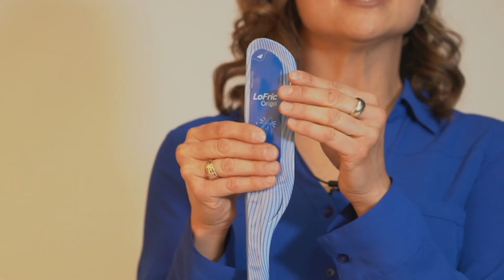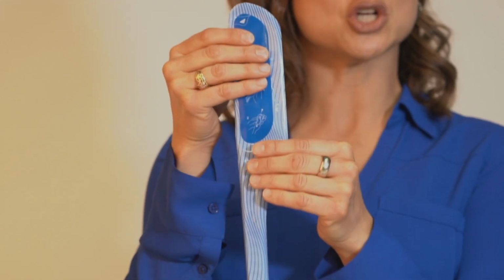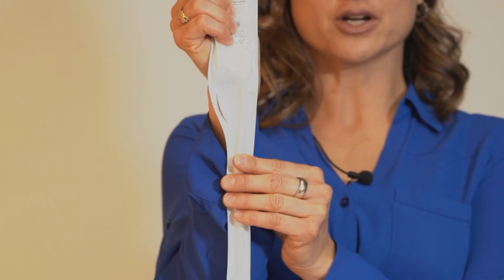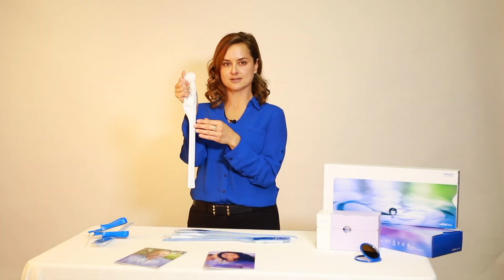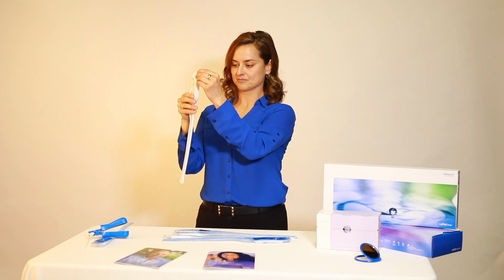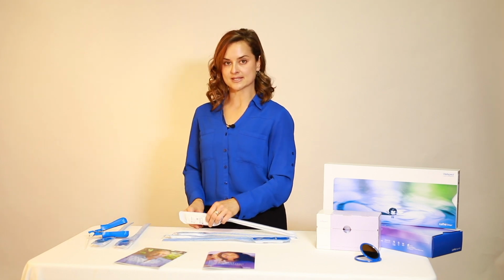The second method I'd like to demonstrate on how to release the salt solution sachet is by feeling for where that salt solution sachet is at the top of the package, and then push down with your four fingers against the heel of your hand, and again you can hear it release or feel it release, and it fills the chamber that the catheter is sitting in. So I won't open that one. We'll move on to the next method.